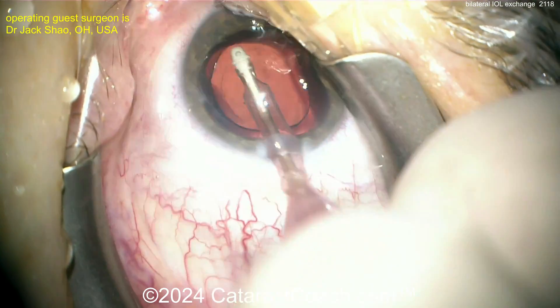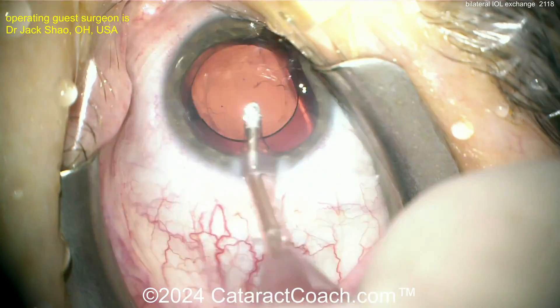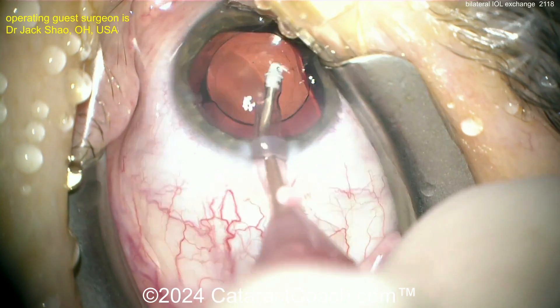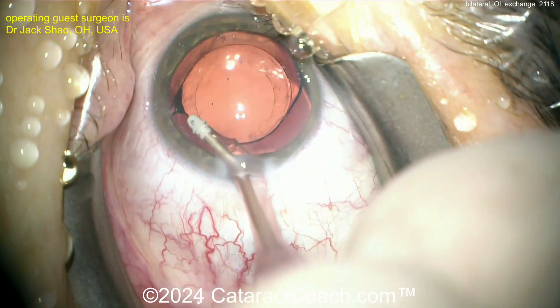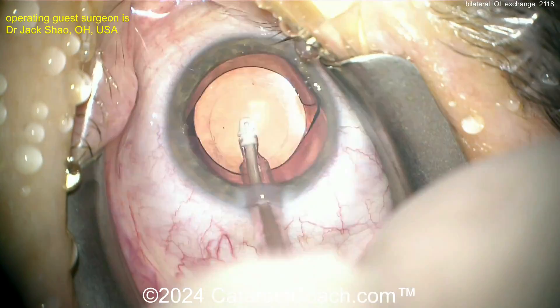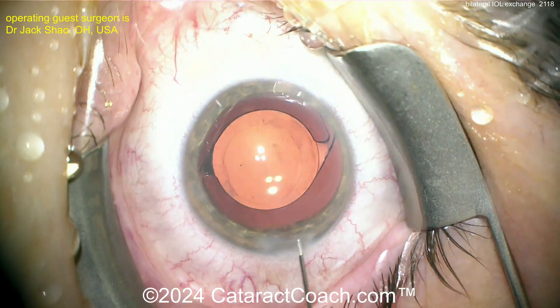Remember: every time you go back inside the eye, tissues are weaker and you're causing additional endothelial cell loss of the cornea — no question about it. The patient can do fine, but there's also higher risk. What if the capsule breaks? What if the haptic gets stuck? We actually have a video coming up where the haptics are stuck and we have to amputate them — that's coming in a couple of weeks.